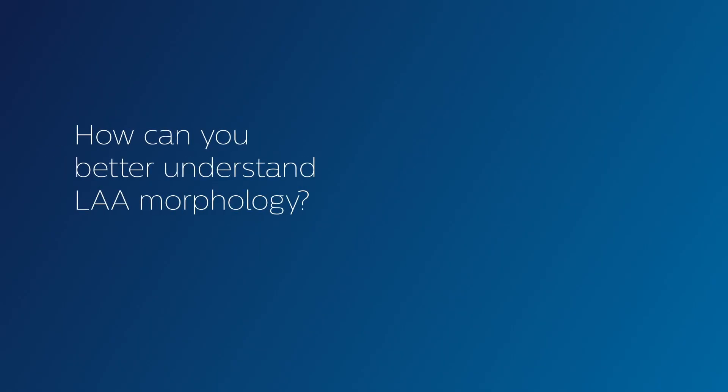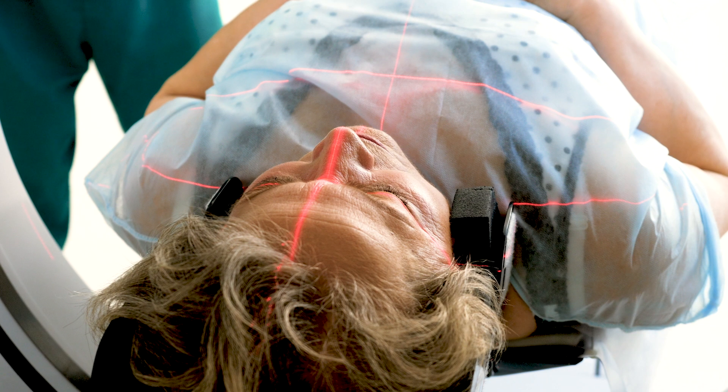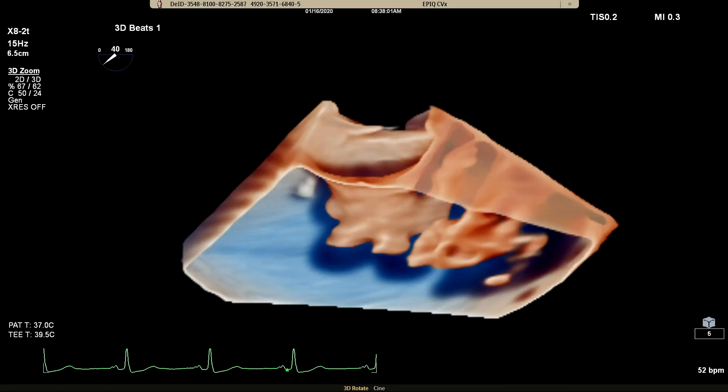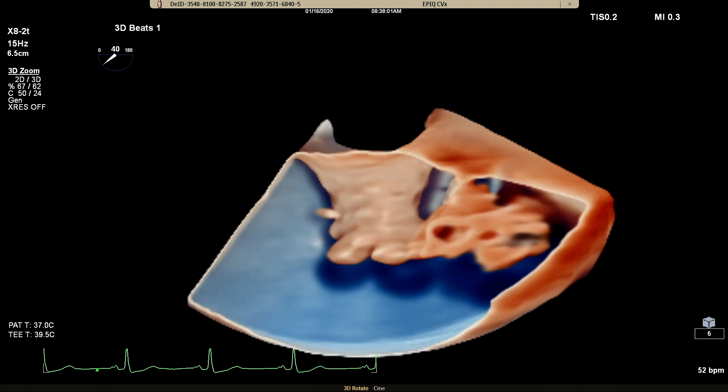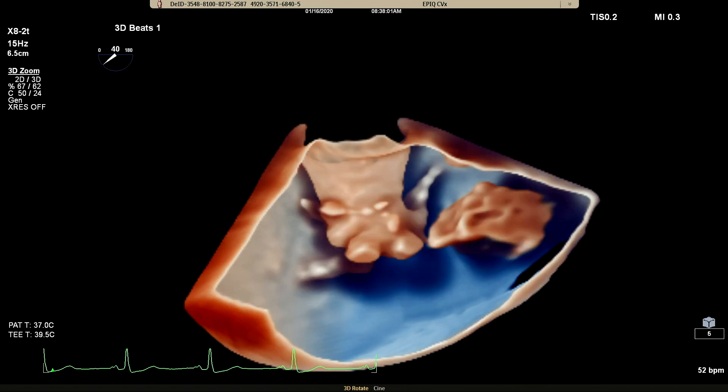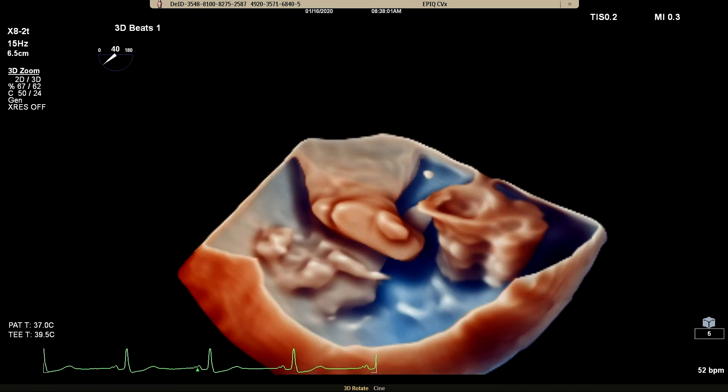So you've seen it and sized it, but how can you better understand LAA morphology? Again, CT is the standard. You can use ultrasound, but getting the information you need hasn't always been easy. Cardiac TrueView Glass enables a new level of LAA morphology understanding. Get the information you need in just a few steps.